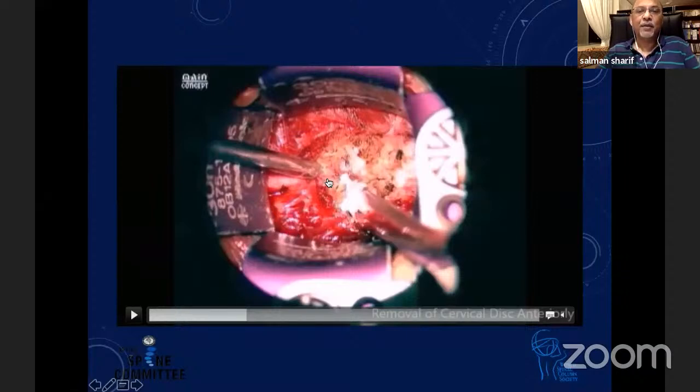And then once you have come in here, you identify, take down all those osteophytes, put in your retractor, clean up the bone on both sides, and then you have a ledge of bone on top of the disc. So you take that initially with 1 millimeter, and then 2 and 3 millimeter punches, and remove that ledge so you can see the whole of the disc space cleanly.